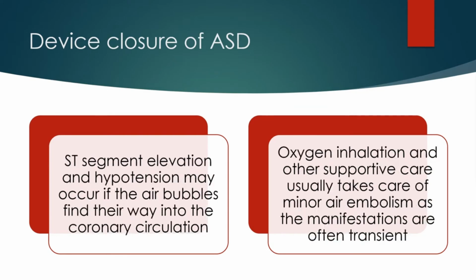ST segment elevation and hypotension may occur if the air bubbles find their way into the coronary circulation. Oxygen inhalation and other supportive care usually takes care of minor air embolism, as the manifestations are often transient.